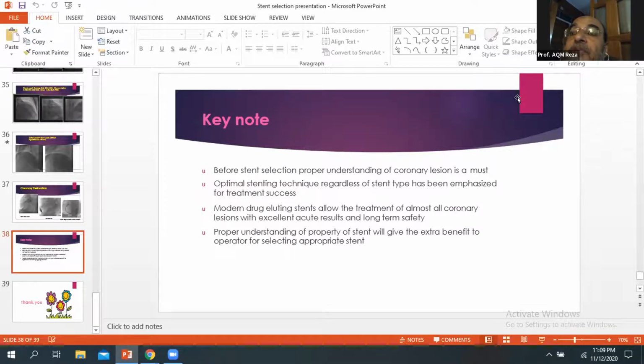When an artery is subtotal or totally occluded, the size of the vessel distal to the occlusion we cannot usually estimate beforehand. So after predilatation, we have to use intracoronary nitrates, then again give a contrast, and assess the actual size of the distal portion of the artery beyond the lesion. Most of the time, when we have to put a stent from LAD to left main, this is very helpful to choose a stent where the mismatching of the stent is less. I think this is my comment.